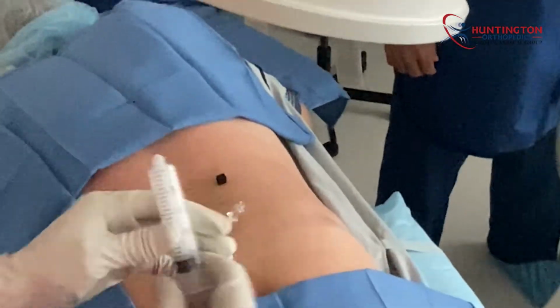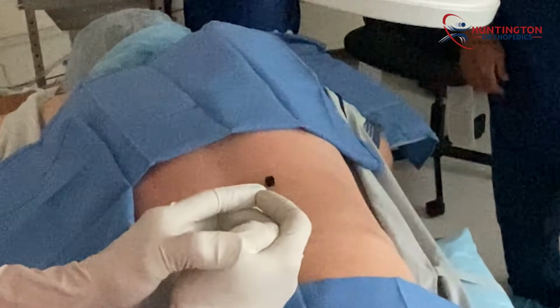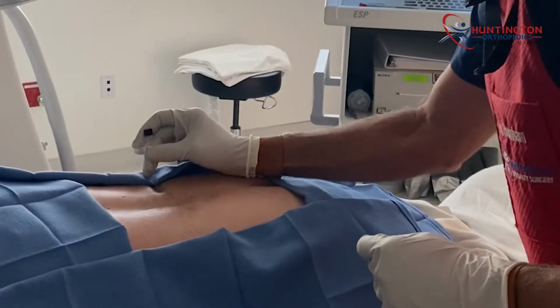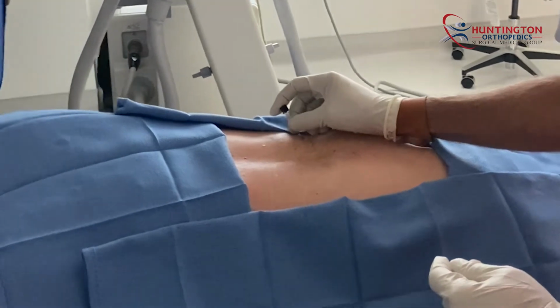We also do a procedure to try and evaluate the sacroiliac joint, and we can put these small needles into the sacroiliac joint as well. That's the joint that forms part of the pelvis from the sacrum to the ilium, or the bone where people say when they put their hands on their hip, that's the ilium.